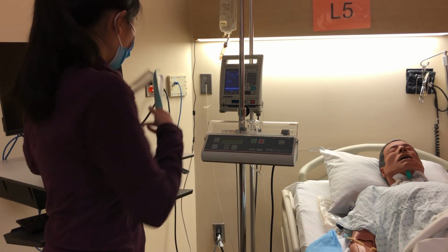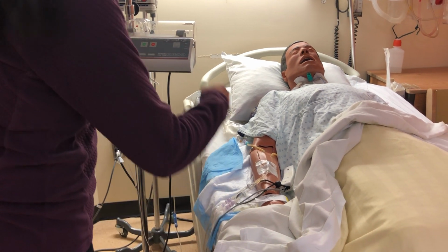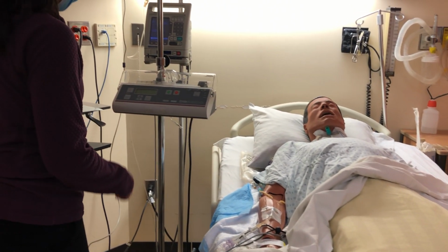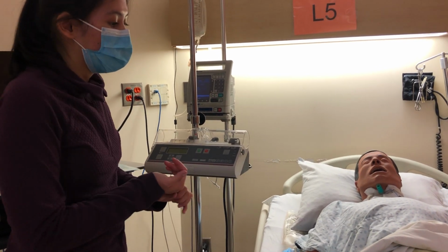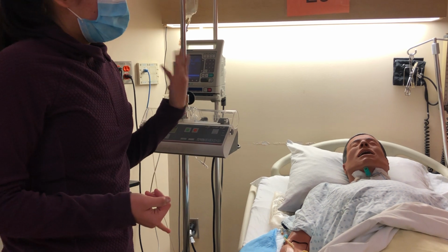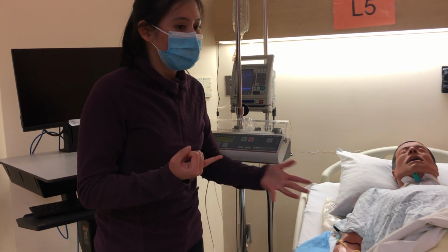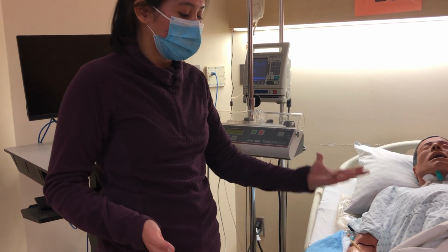So now it's confirmed. At this point, I'm just going to check the patient's IV site. No signs of infection, no swelling. And I'm noting that I also have a carrier here of normal saline that is compatible at TKVO. So, Mr. Tyson, I have here your fentanyl medication to help you control your pain levels. I will be closely monitoring your pain levels every hour, documented, as well as the sedation scale, also your vital signs, your respiratory rate. Side effects you should know are nausea, vomiting, dizziness, palpitations, if you're having trouble breathing. If you feel any of those, please use your call bell and we will help you.